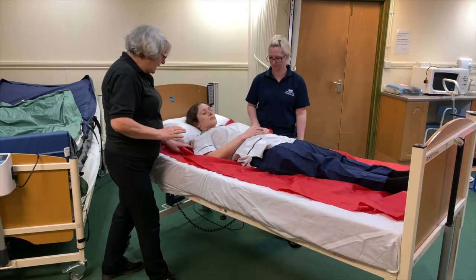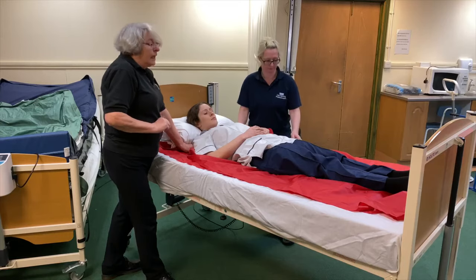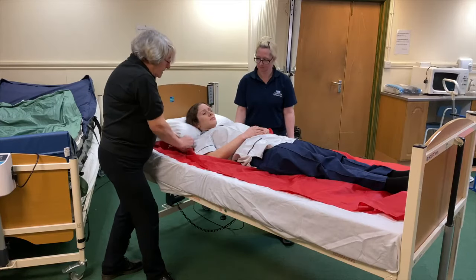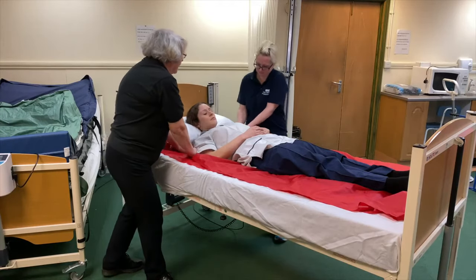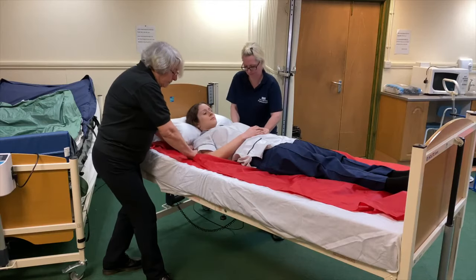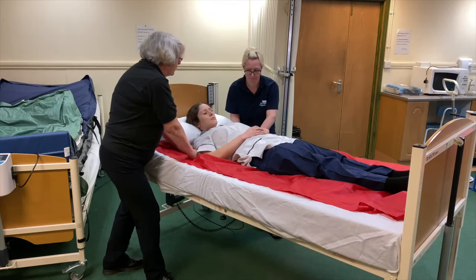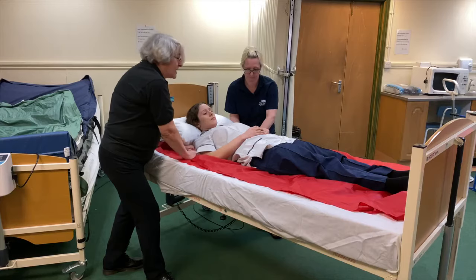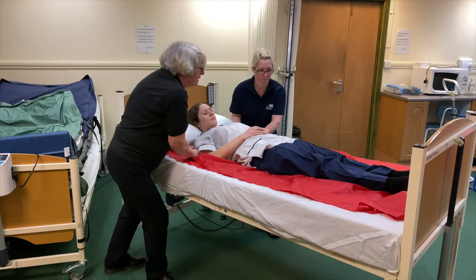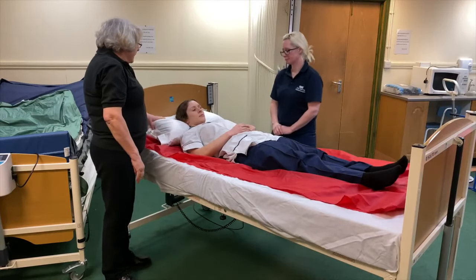We are now going to put our hands at the top of the glide sheet by Alice's shoulder. Okay, and because we need to keep our elbows close to us and not reaching out, our other hand is going to come here as well. Okay, there are slightly different hand holds, but if my hands are down on the bed, facing down the bed, they're going to come like that. Okay, and we are going to give the command, and the command is going to be ready and slide. Are we okay? Yes, Lisa? So ready and slide. Ever so gently, ever so gently. We do not need to think about anything else.